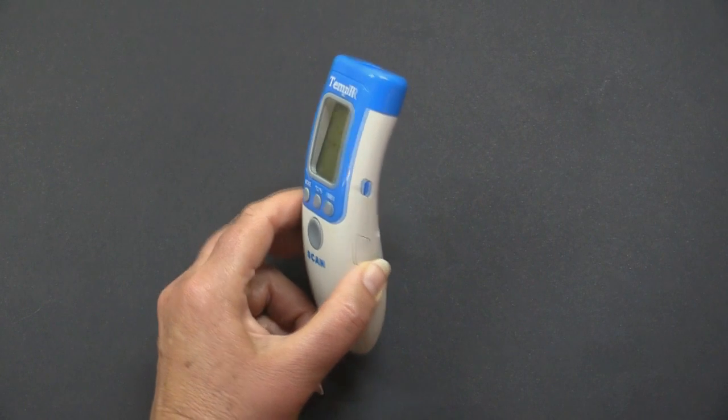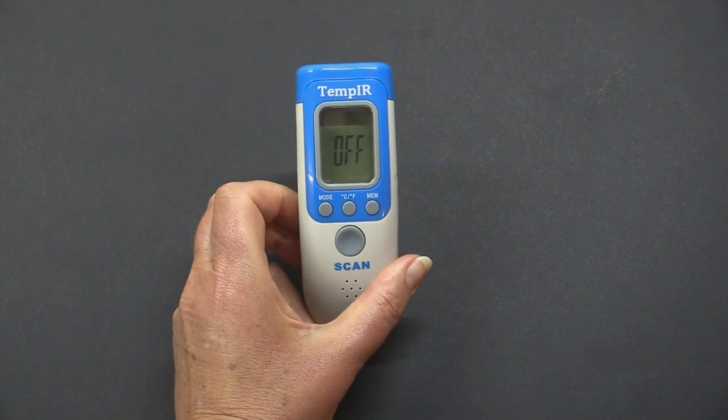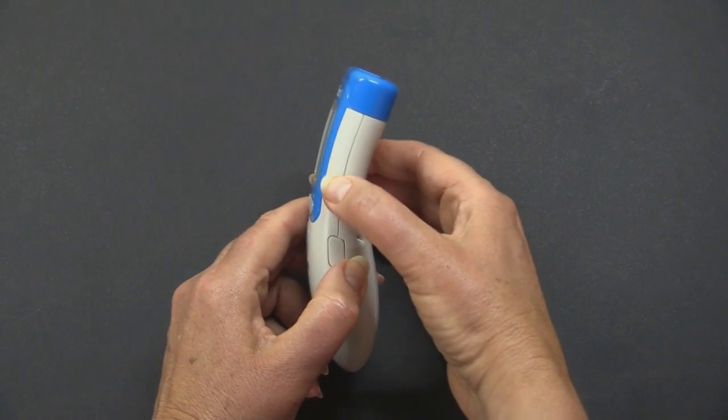To turn the sound off and on, press the blue button on the right hand side of the unit. The screen will display whether the sound is either off or on.